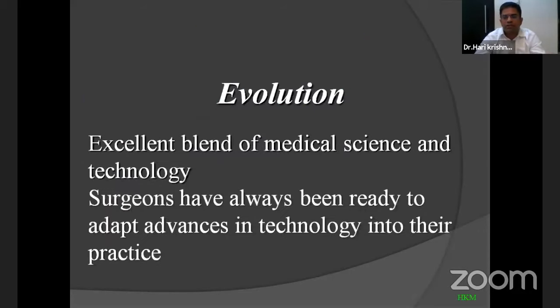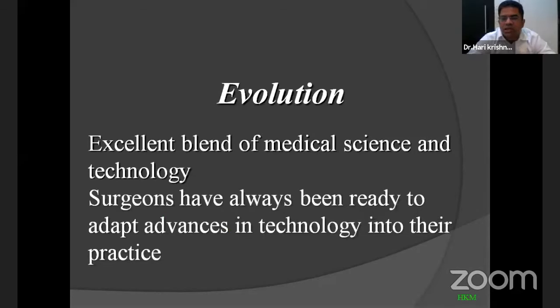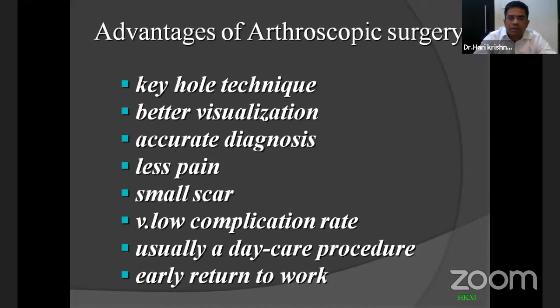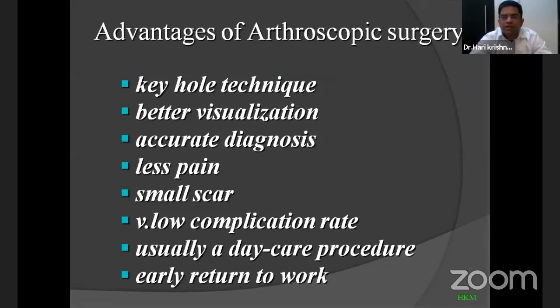It's an evolution which goes on in any field. In orthopedics especially, the evolution of arthroscopy started way back in the 1900s. As surgeons, we have always been ready to adapt advances in technology into our practice. The advantages of arthroscopic surgery are that it is a keyhole technique with better visualization and accurate diagnosis. Because of the minimal keyhole approach, it is less painful, with a small scar and a very low complication rate, and it is usually a daycare procedure.